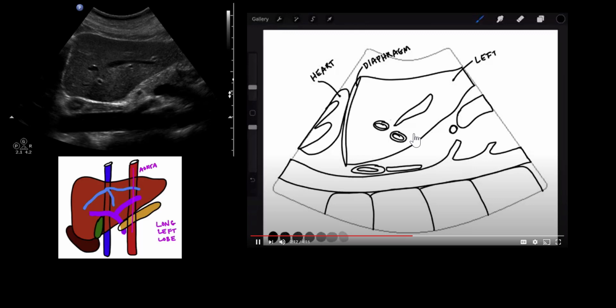And a larger section of the left lobe of the liver at the level of the aorta. We want our aorta nice and extended along the posterior portion of our image, showing both the celiac axis, which is the first branch of the aorta, and also the SMA, or superior mesenteric artery, the second major branch of the aorta.